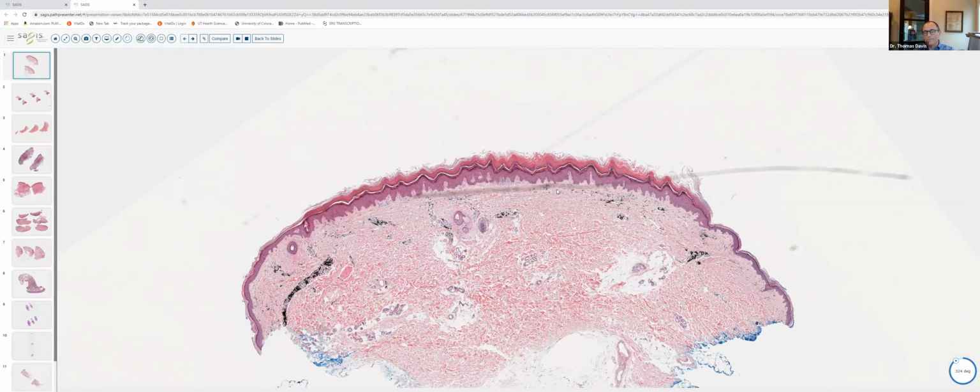If we look at the bottom piece, however, in the middle of the abscess, we see this brown material here, kind of light tan or golden brown, really, in the center of the abscess. And moving down to higher power, we can see that this material has very thick cell walls, and the cells have kind of a honeycomb pattern. And this, of course, is very characteristic of plant or vegetable material. This, of course, is a splinter, and it frequently induces a fairly brisk inflammatory response, as any of you know who've had a splinter.